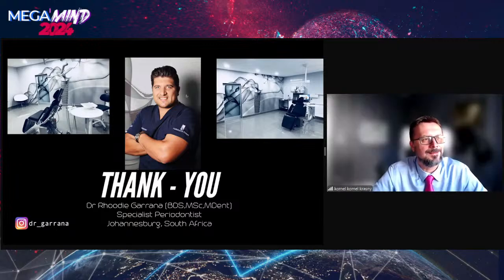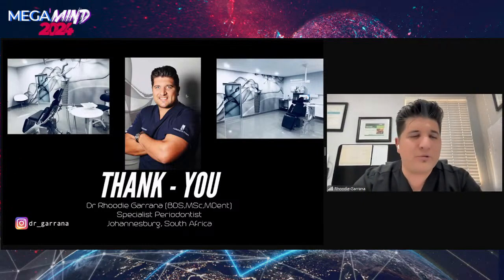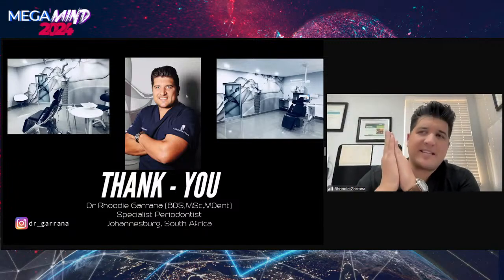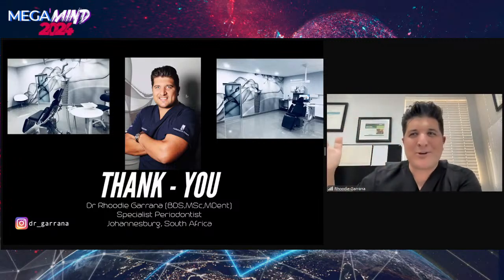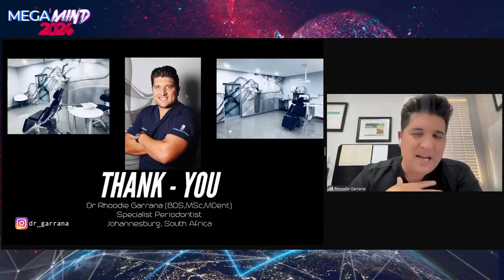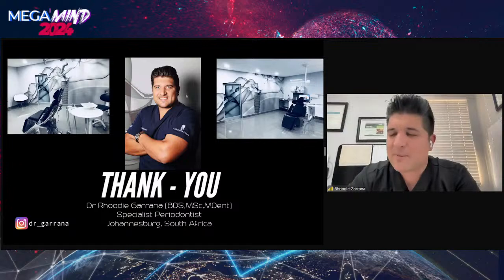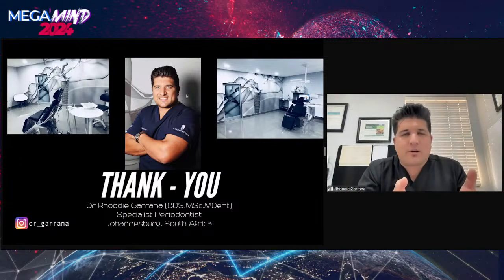I've been using Socket Shield for about 5 years, Doc. And if I'm honest with you, I can say that if I look at the best aesthetic results I've got, it has been with Socket Shield. Some of the worst complications and failures I've had have also been with that. That is my experience. It is not the opinion of many of my mentors and others alike, but certainly I find that when it works well, it is time consuming, it is technique sensitive, and it requires a lot of attention.